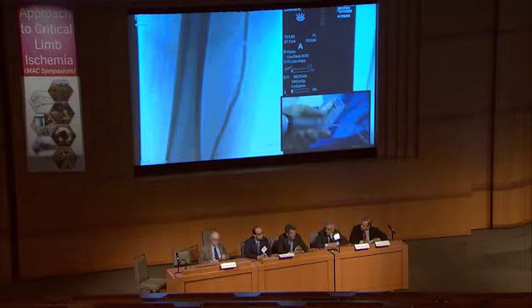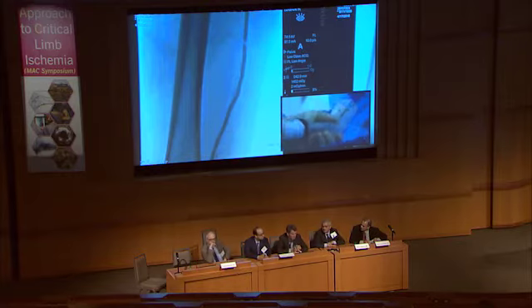Can you bring me a 6 by 120 Supera? For me, seeing this kind of artery, I think the only solution you have is Supera. Atherectomy maybe to prepare for the implantation of a Supera at some areas of this very calcified plaque, but at the end, I think you cannot come along with other devices here, except for Supera. Yeah, I've been impressed Supera even gives good patency in this sort of situation, which in the past was pretty hopeless for us anyway.